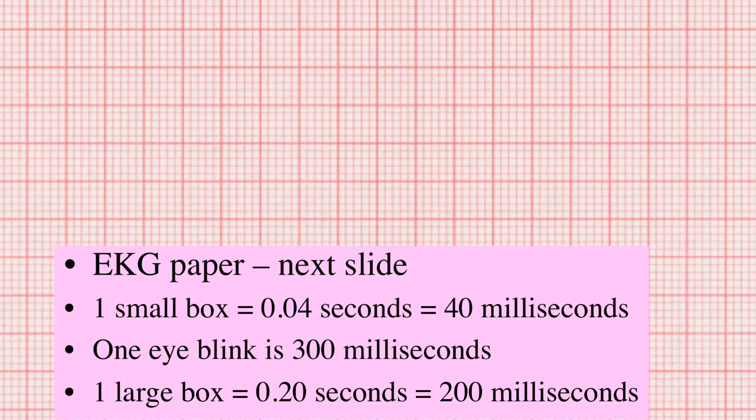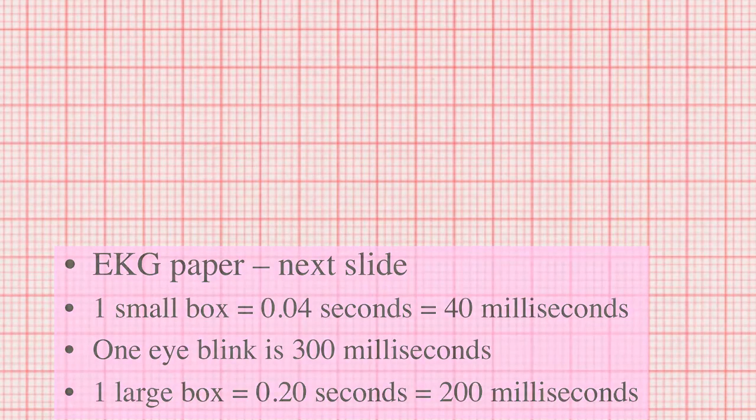I'll click forward again to look at the EKG paper. Usually it's best if it's on this kind of pink background, with usually a black pen either marking on it or burning into it, and then you get that contrast.